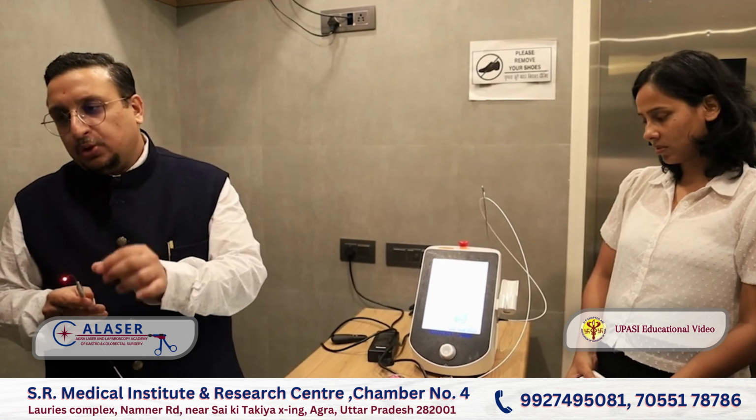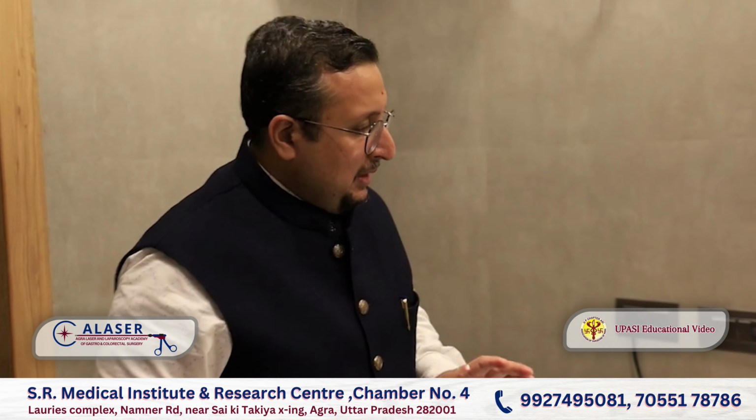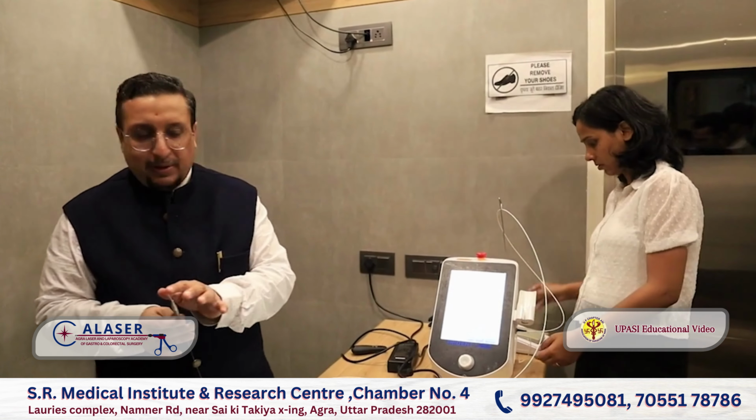Aiming beam is used because laser has no light. We just give a red light to it. This is the aiming beam to show you the tissue direction. That's it. Laser has no light. Right? Simple. This was the bare fiber.